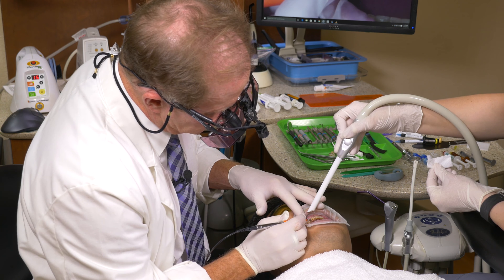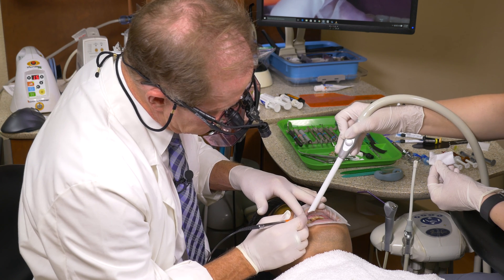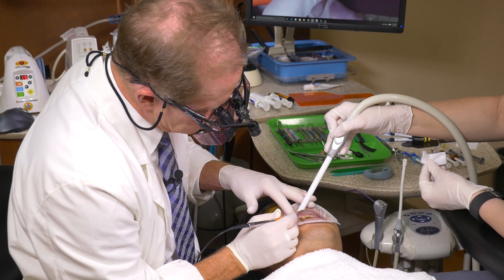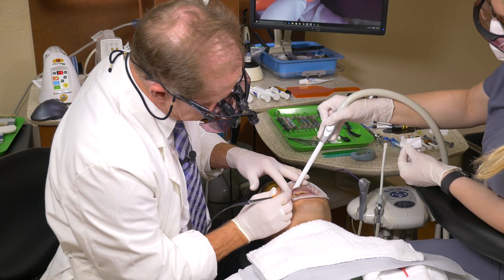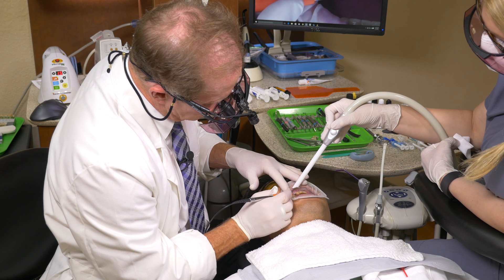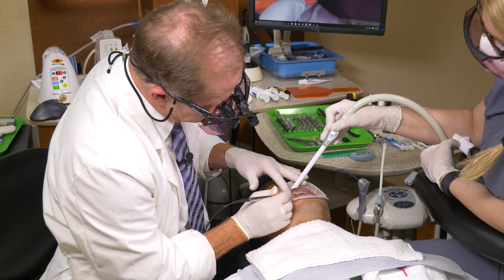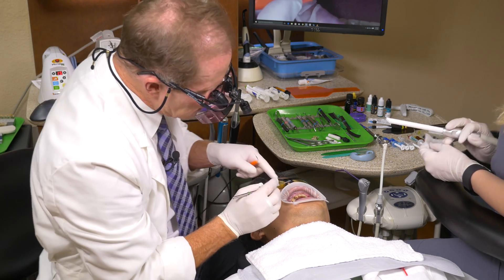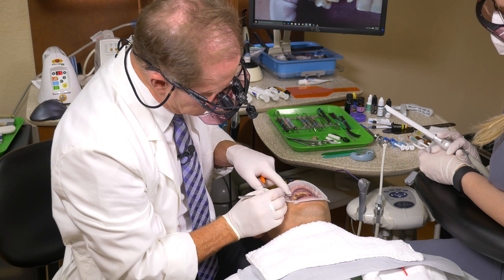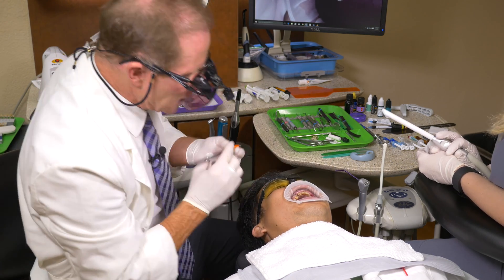The tissue will stay exactly where we put it. We're then going to create a provisional that will maintain that site. The mistake I frequently see — not only with clinicians I've worked with, but also in the laboratory — is dentists will make this ovate pontic site too small, so it really doesn't correspond to a root form. This is a touch laser. Typically I like to go about two to three millimeters deep — I want to go as deep as I can. We do need to make sure we have enough tissue between the apex of the pontic and the periosteum — we need at least a millimeter. So I go ahead and probe: I'm about three millimeters, which means I can go two millimeters deeper, which will make a really nice ovate pontic design.